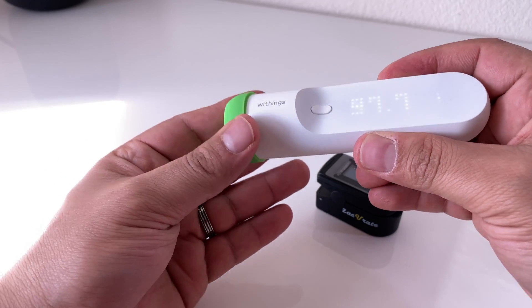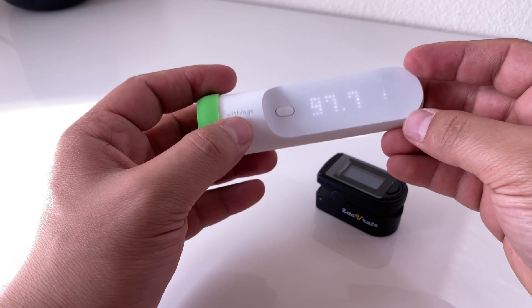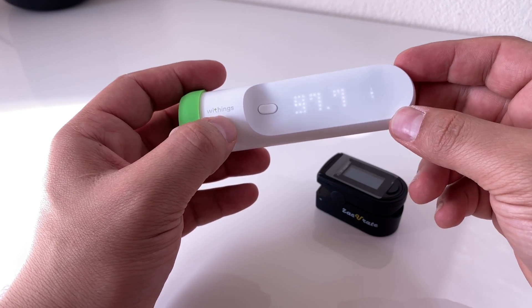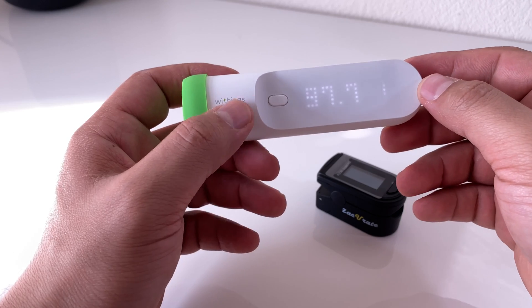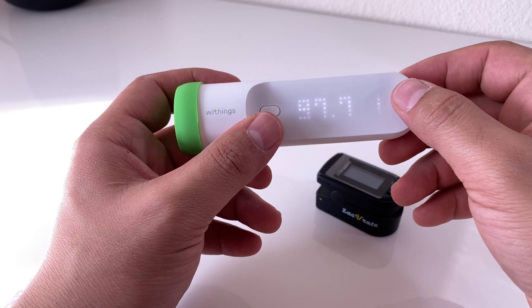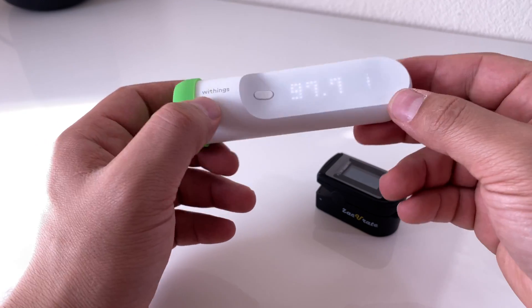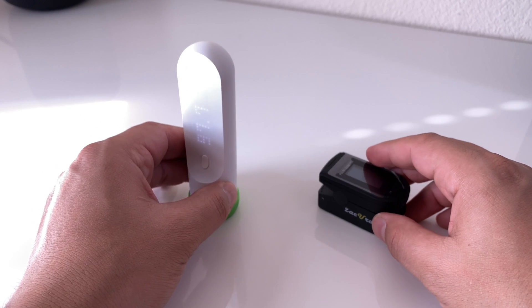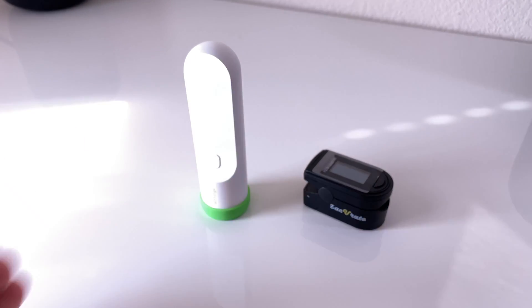It keeps track of your heat and temperature. It has a touchpad so you can use it to select the name and choose which account or person is going to be using it. These are the two devices that I highly recommend buying. If you guys have any questions, let me know — take care.